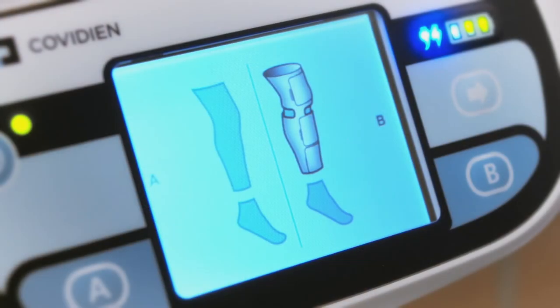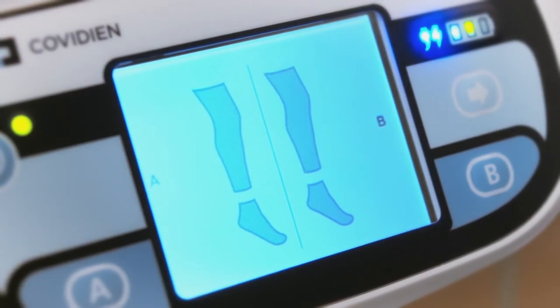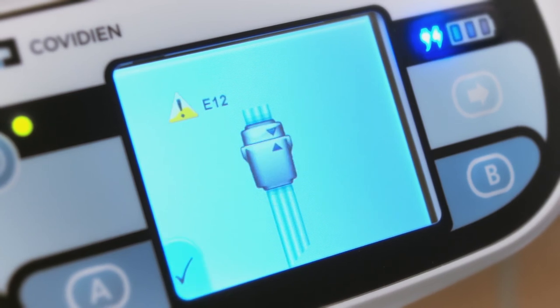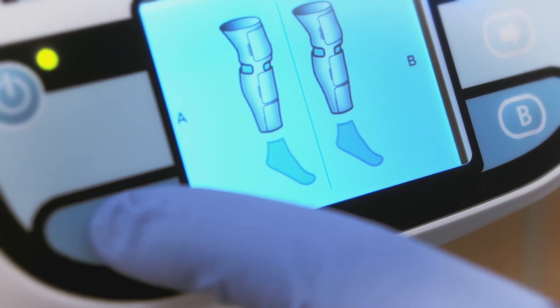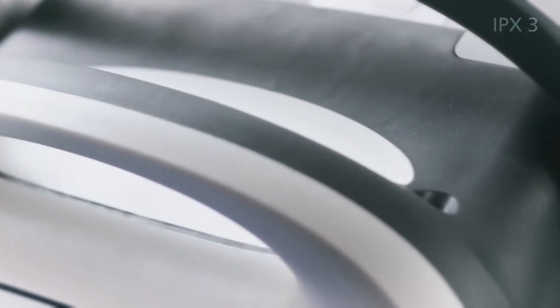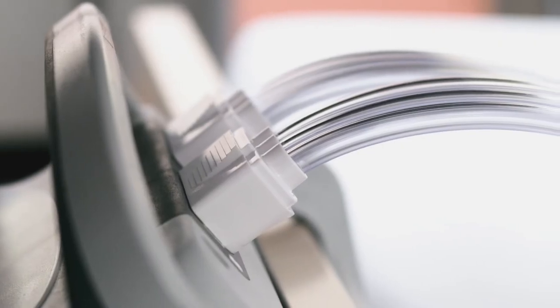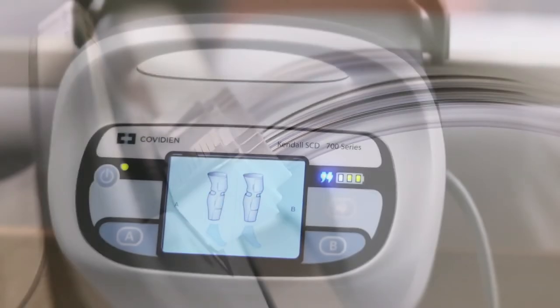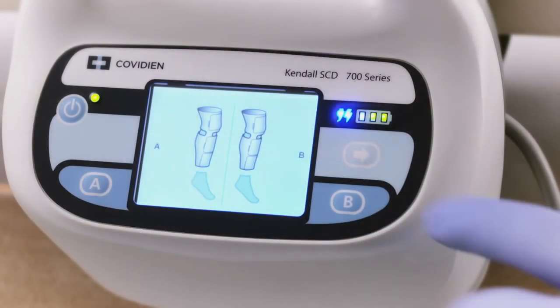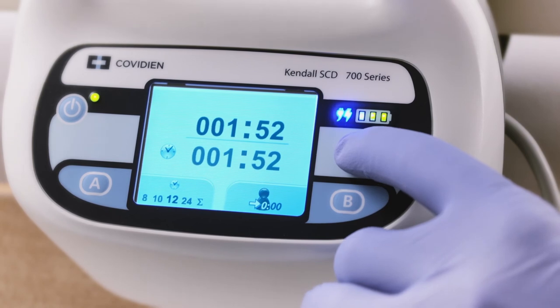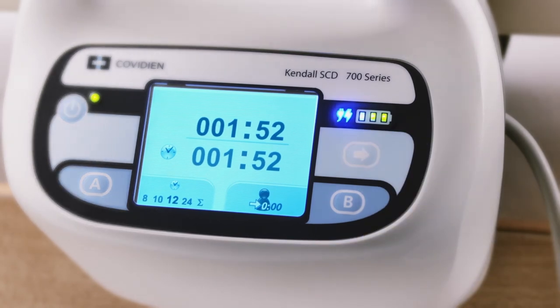A graphical user interface allows for intuitive operation, including animated error code resolution. An IPX3 rating ensures a more durable device less prone to liquid ingress. A reduced noise output keeps nurses and patients comfortable, and the device also has a patient compliance meter allowing clinicians to track the patient's duration of therapy.